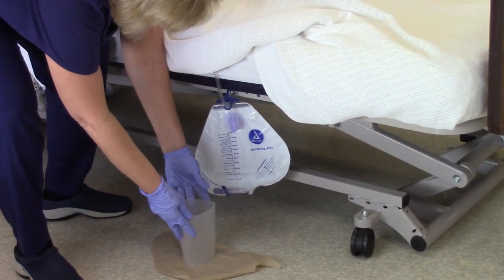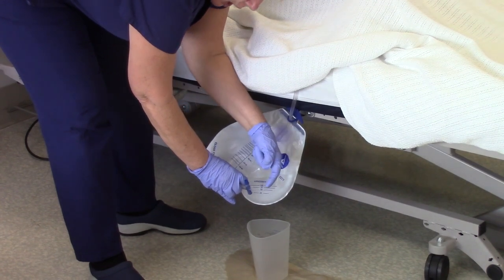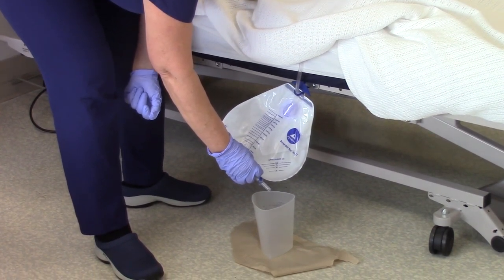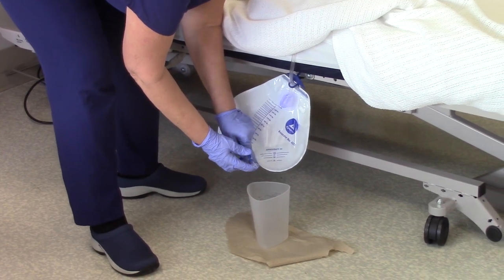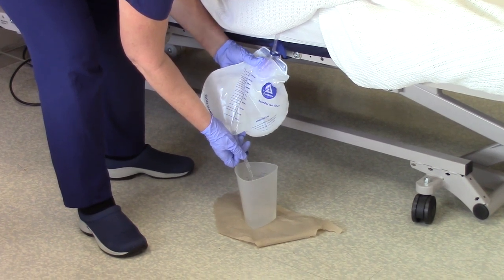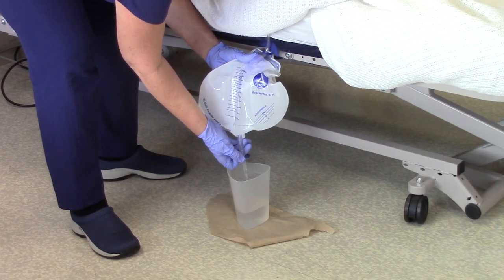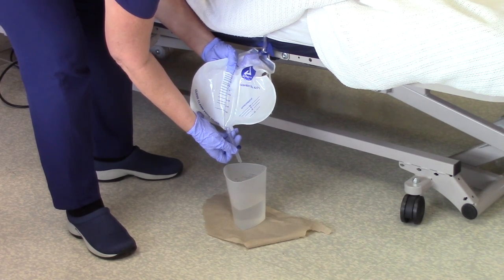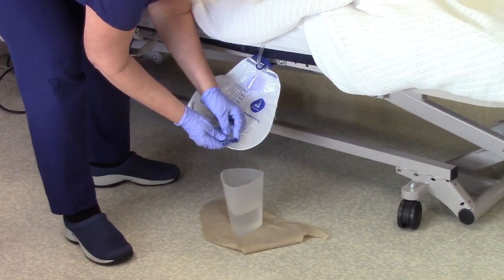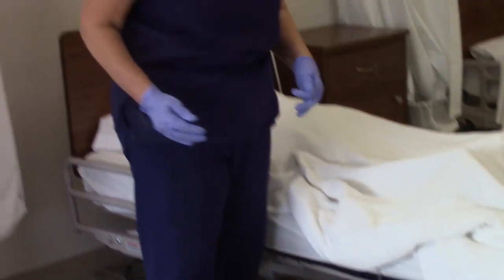Now that you've done your assessment and everything is good, you are ready to empty the bag. Come over and take the tubing out of the pouch. It is critical that you do not touch the tip whatsoever, because it is considered clean. When you empty it, do not touch the edges of your graduate, because you will contaminate it. I will push this area down and allow the urine to empty. I am not touching the tip and I am not touching the graduate. Once all the urine has emptied, I close the valve and put it back into the pocket.